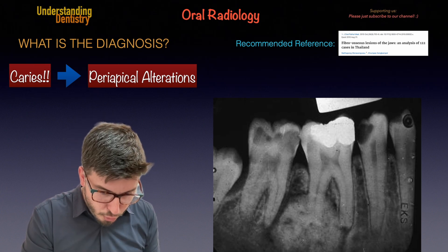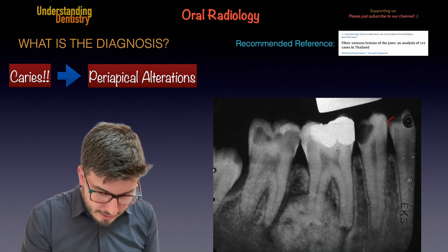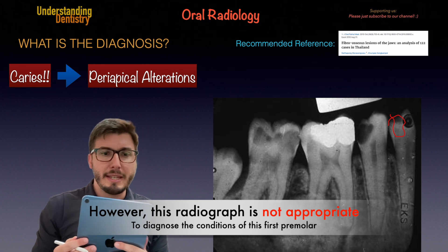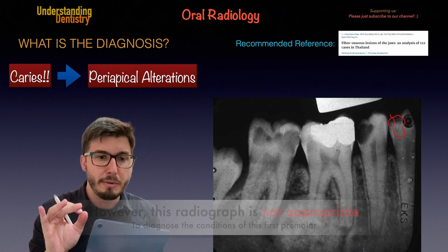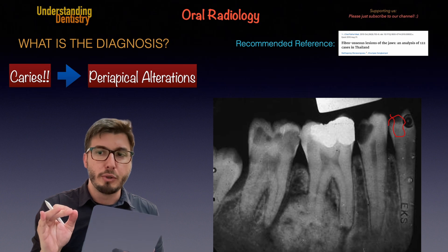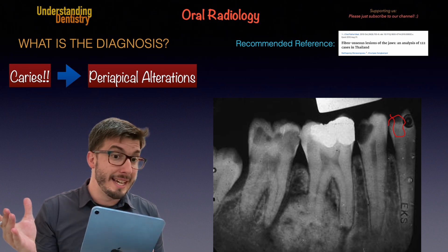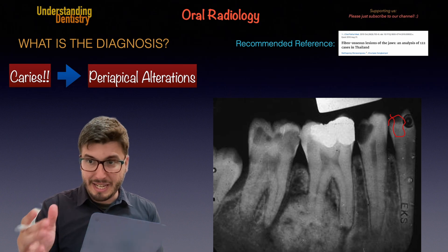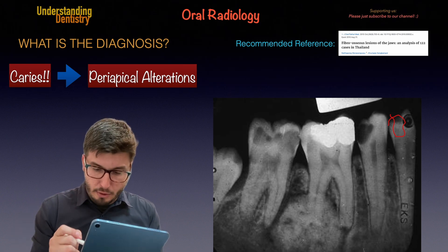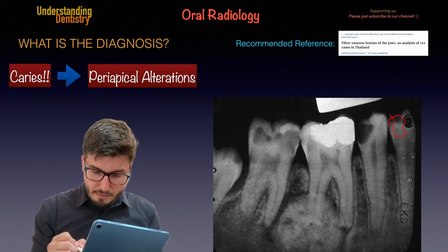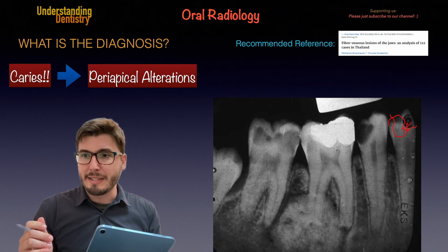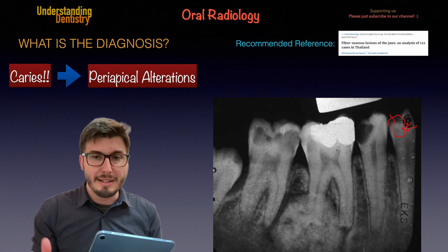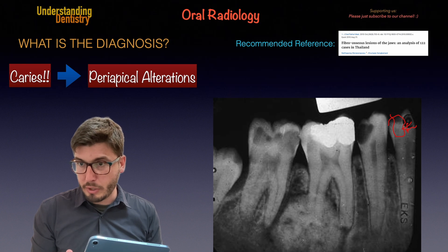Here we have occlusal caries, although you would be surprised if this has no clinical diagnosis. As you guys remember, the clinical diagnosis is the main one — the ICDAS classification is the main one for occlusal caries. But we are seeing that in the dentin, the beginning of the dentin, very close to the enamel, we can see that it's more radiolucent than the rest of the dentin. And then there is the clinical diagnosis of occlusal caries.